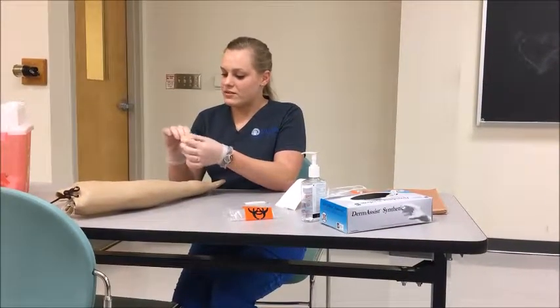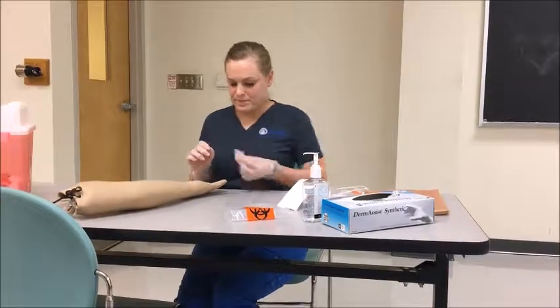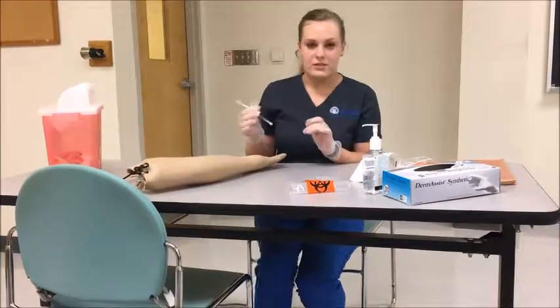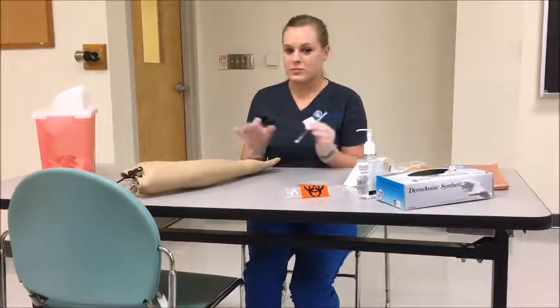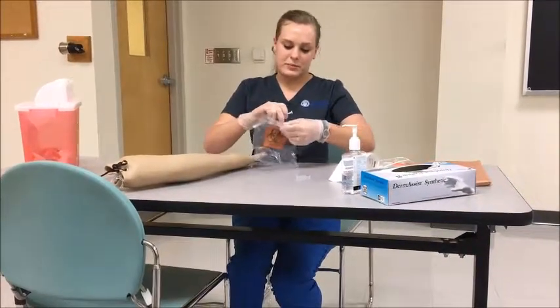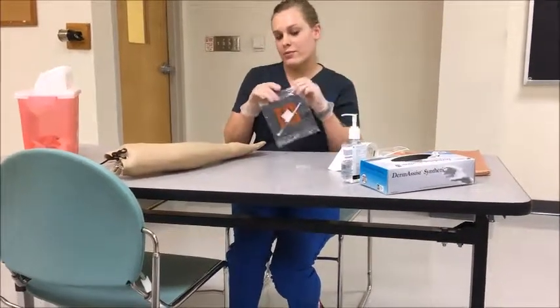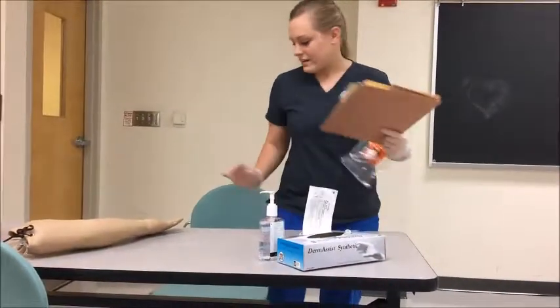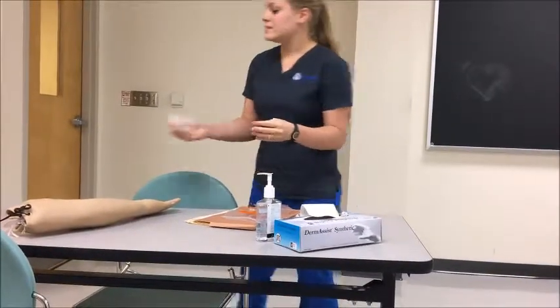I'll put a band-aid on. I'm going to label the patient's syringe to make sure the sample doesn't get lost. If this procedure were to take longer than 10 to 15 minutes, I would need a bag of ice so the blood stops metabolizing. Then all waste gets thrown away, the syringe gets placed in the biohazard bag and taken to the lab. I'll document everything in the chart, remove my gloves, and decontaminate my hands with hand sanitizer.